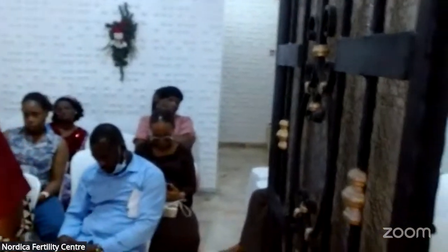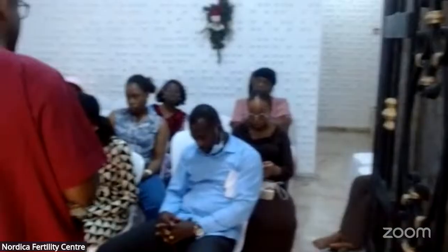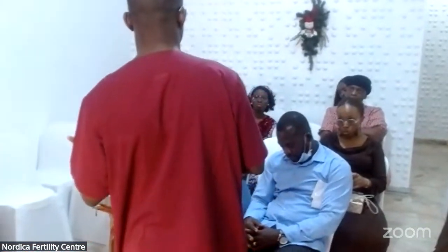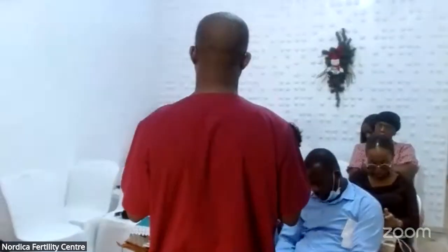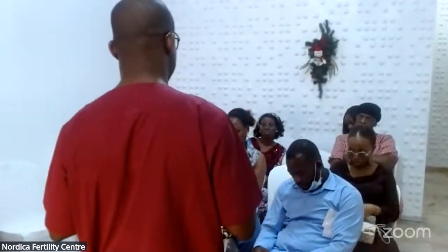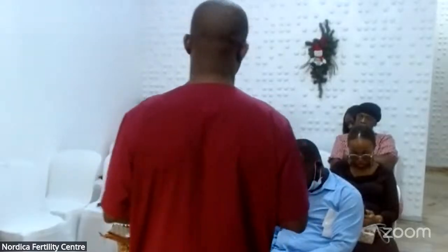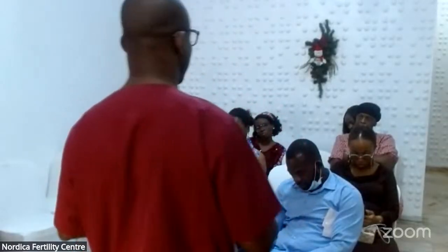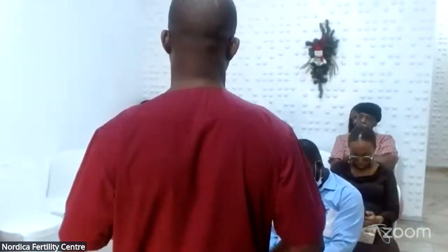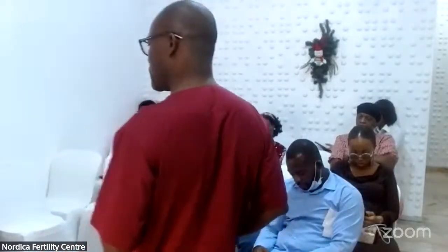A patient is telling you that, oh, my tummy is going down. And the doctor is scanning the patient, saying that the fibroid is the same or even bigger than the size before Hifu treatment. It doesn't make any sense. The tummy is going flat, and you are saying the fibroid is increasing. It's because they don't know what to really look out for. So we hope that with time, when we are able to train more people, they will get to know what to look out for when they are scanning the patient after Hifu treatment. Next slide.